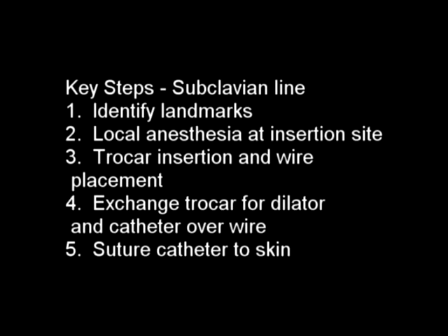Key steps: subclavian line placement, identification of landmarks, local anesthesia at insertion site, trocar insertion and wire placement, exchange of trocar for dilator and catheter over wire, suturing catheter to skin.